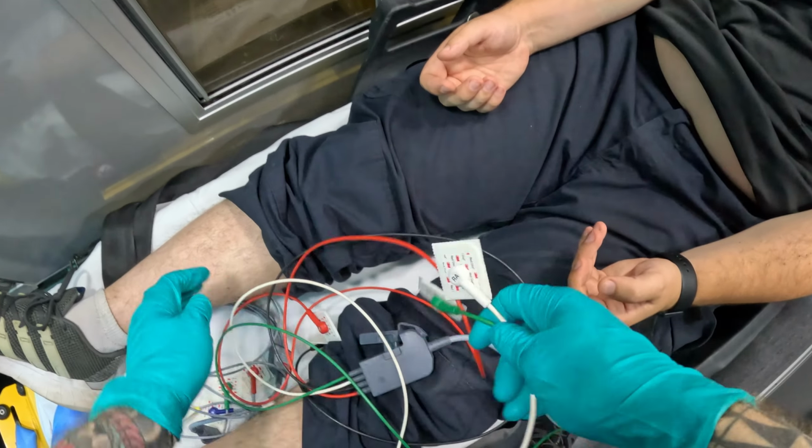And if your patient is conscious and alert, you could ask them to do the same thing, put their finger in there. So this is V1. You can move your finger. And then V2 is going to be on the same space, the fourth intercostal space, to the side of it. So now V1 and V2 are in place.